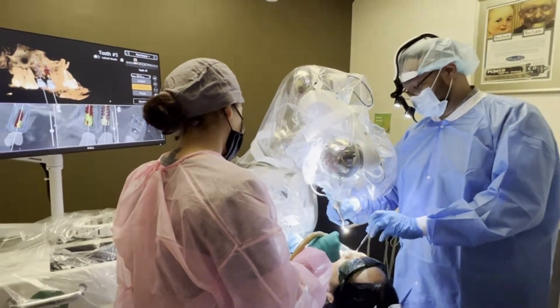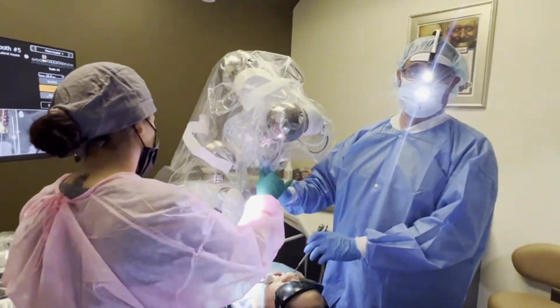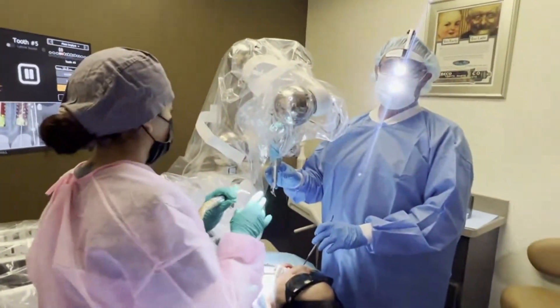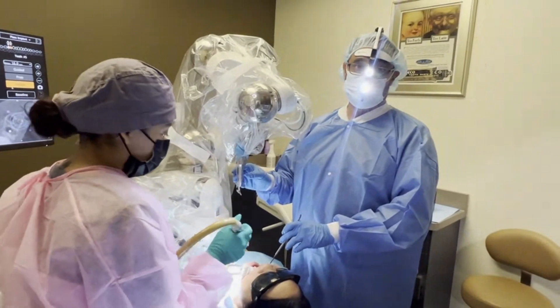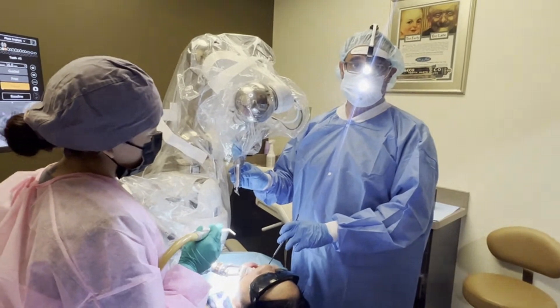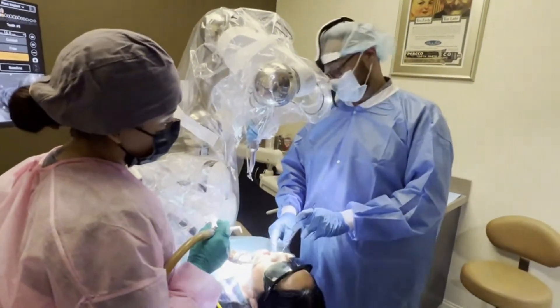Perfect. So we just placed 2 beautiful implants, according to the plan that I had pre-programmed into the computer. To confirm, we're going to take another CBCT and superimpose it on the pre-plan already in the system to make sure we went to the right position — but I can tell visually, this is exactly where I had planned.